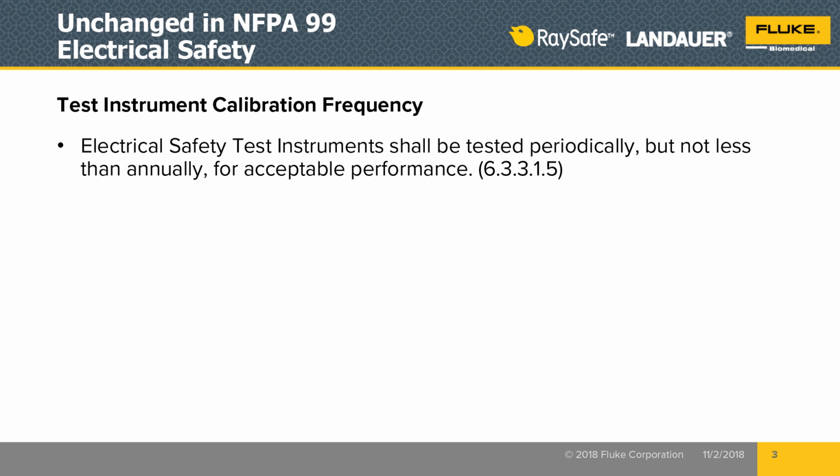Wanted to start off highlighting things that haven't changed, so hopefully this is old hat and everybody's aware of this, but dealing specifically with the test equipment that you're using to test to NFPA 99, unchanged from past editions, 2012 and newer still mandate that your test equipment needs to be checked and tested for acceptable performance at least annually.